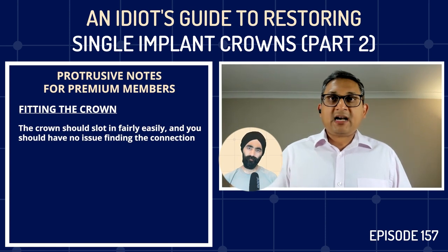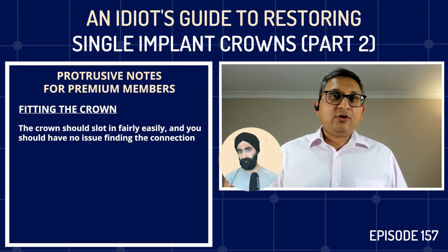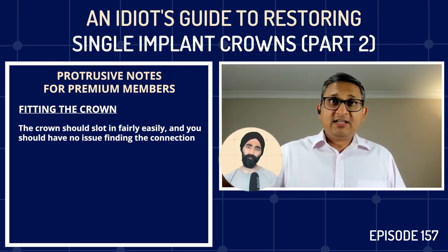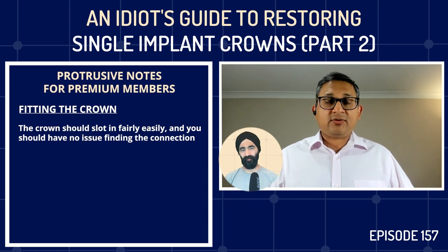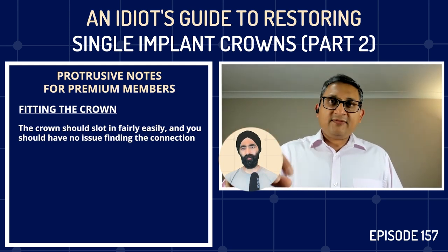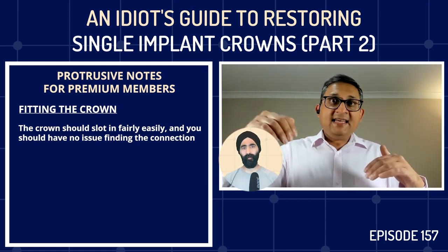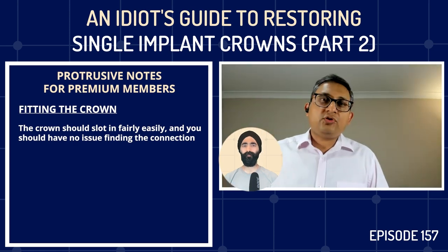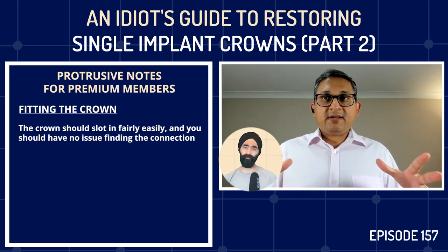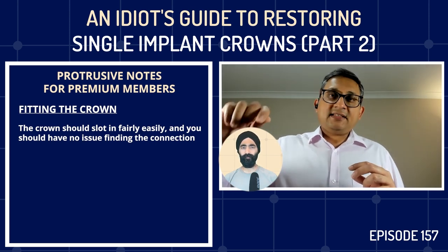When you put the crown in, it should slot in — most implants have some sort of hex connection, so you'll feel the crown slotting in. If the crown is really compressing the gum a lot, you might not feel the connection. Generally you will feel it, slot it in, and then start screwing the screw in. As soon as you feel the first resistance, stop and check the contact point, because if the impression post moved slightly, the crown might not be in the exact position.